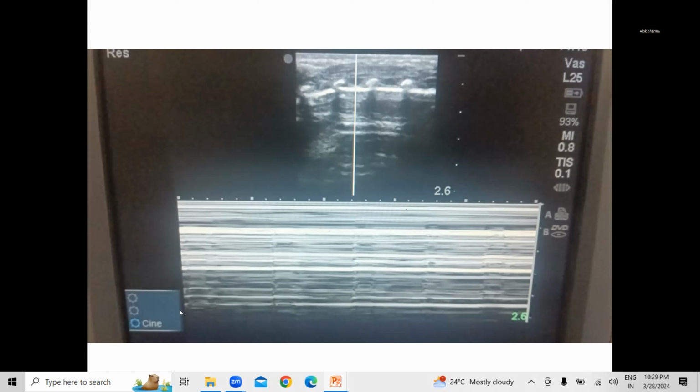So basically, this is where you're seeing subcutaneous tissue, which is giving you the profile. That's the pleura, that's the reverberation artifact that you can see all the way through. This is your classical barcode sign. Now, the problem is if you lose your depth and you have just 1 or 2 A lines, you will predominantly get what I would say is the shore. But in terms of the sandy beach, if the distal lung is okay, because they're sliding, the shimmering of the pleura gives you that sandy beach appearance, and it's because of reverberation artifact moving down.